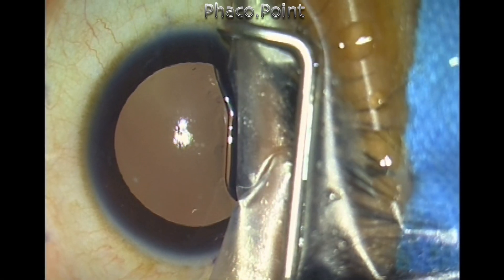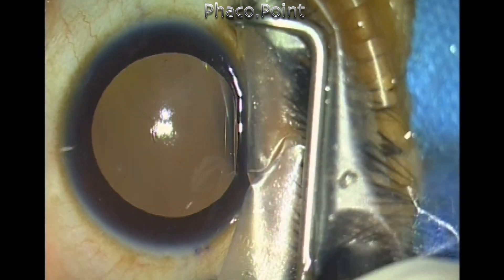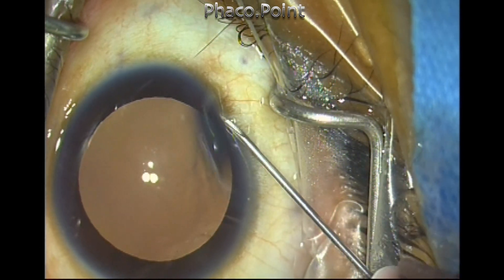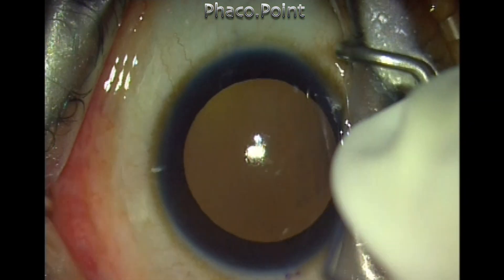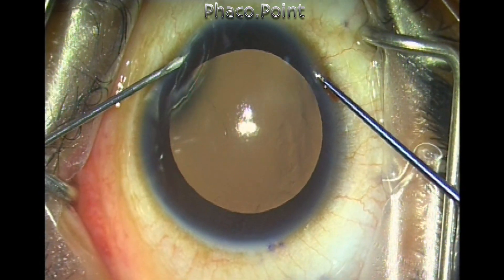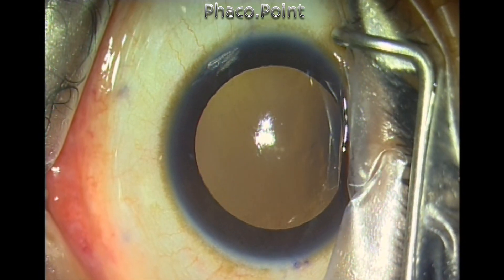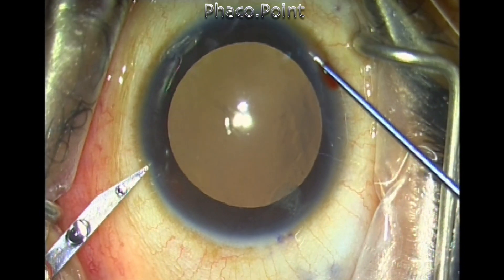Here is the use of a corneal pocket incision in the implantation of an ICL in a young 23-year-old high myope who also tended to have a prominent Bell's phenomenon — the superior limbus kept disappearing underneath the speculum. I first create the pocket incision at 10 o'clock as well as at 7 o'clock position, and these two pocket incisions will enable me to get good control of the eyeball for the implantation of the ICL.